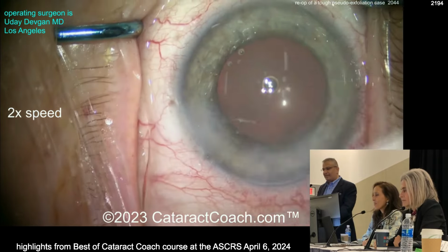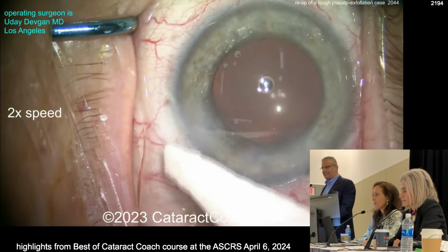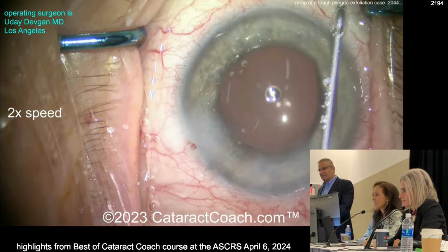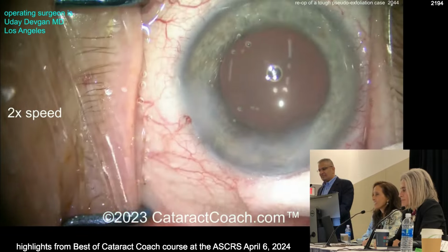A little LRI there so we can fix it, probably a half diopter of astigmatism, and everything looks great. Again, normal pressure. Pretty happy here. Beautiful. Wonderful.